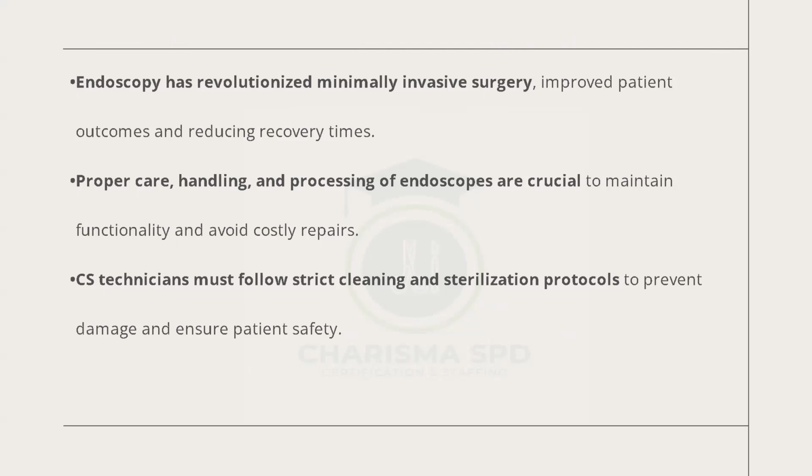Okay, so we're saying it helps minimal surgery procedures with best outcomes. You have to handle it with what? Care, right? And like I said, you have to select the right sterilization method. And you can get that without sweat by looking at the IFU. Okay, so when you get the IFU, it's a book. Just go to how it is cleaned. That's where you can read and see the chemicals that are needed, what you need to do, how it is cleaned. Then look at how it is sterilized.